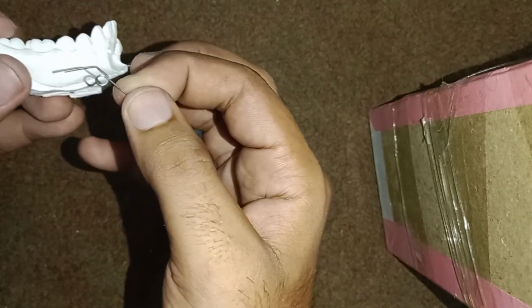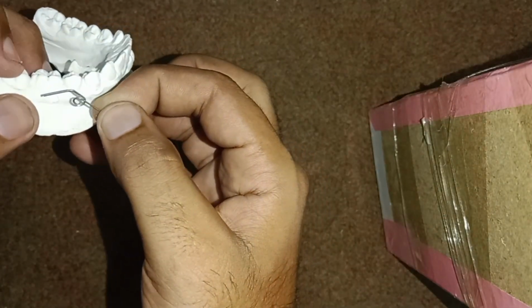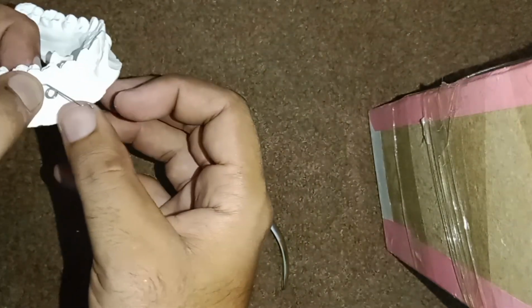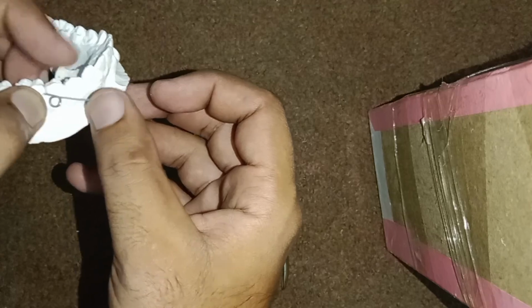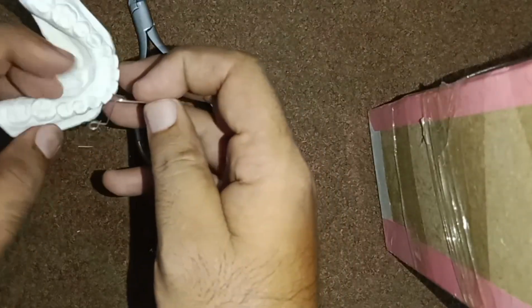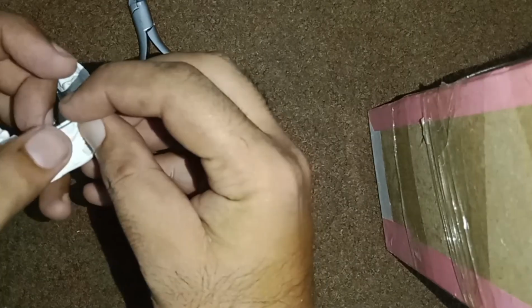This segment, like it is activated in the accessory tube of the molar, will lie downward. It will be brought upward and activated in the hook of the anterior segment.